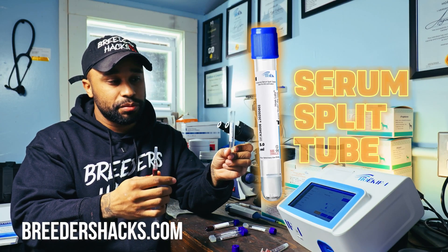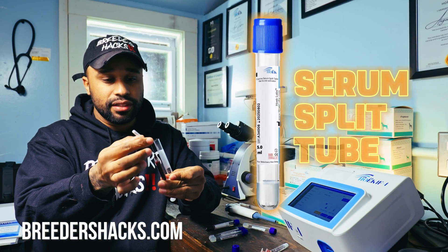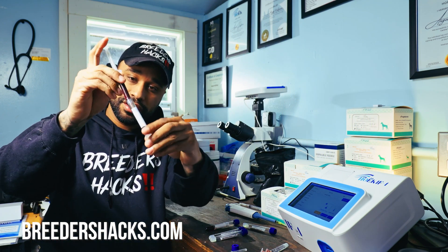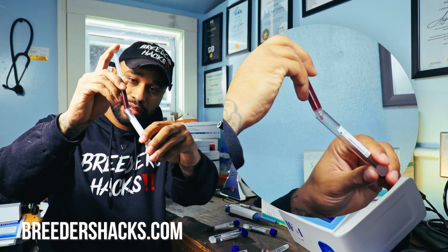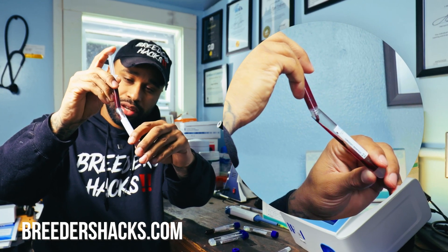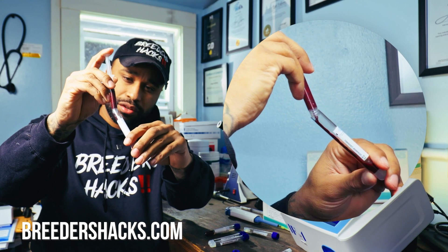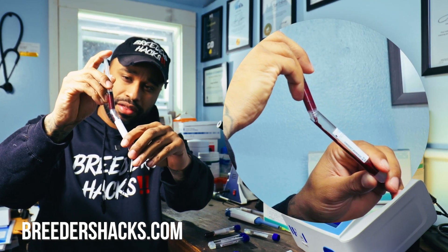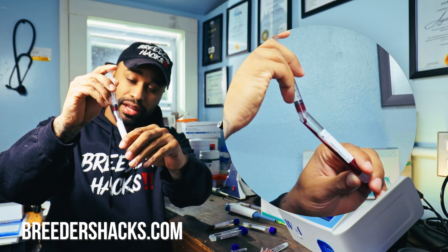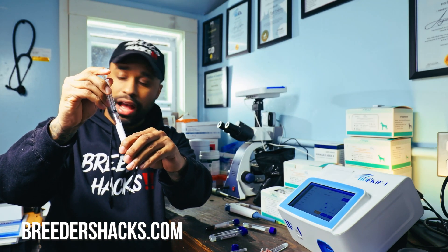So for serum, we have our little mini centrifuge tubes we would normally use, and now I'm going to show you guys a comparison. We have two of those from the same dog, and now I'm going to take one of our serum split tubes, get the top off, and go ahead and put the blood right into this tube. As you can see, this is actually sitting for a moment so it's a little bit thick already — but with a tube like this, it doesn't even matter, and you guys are going to see why.